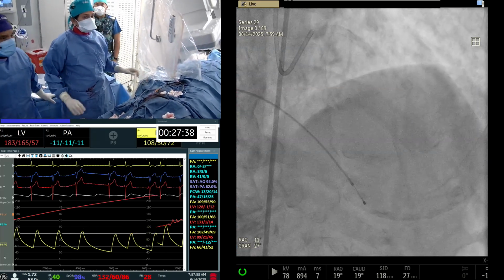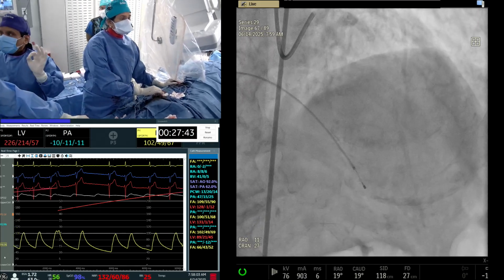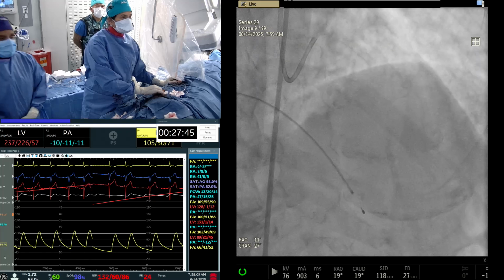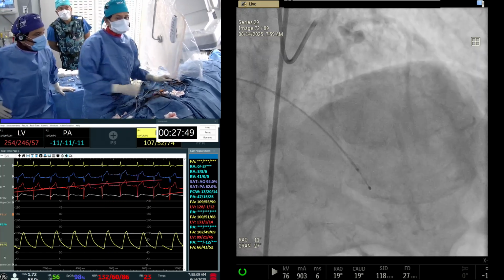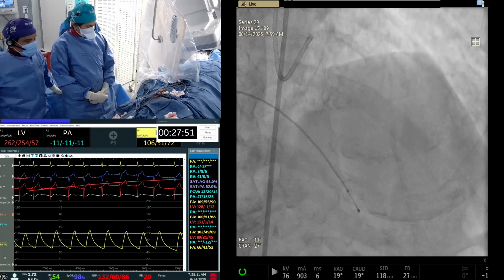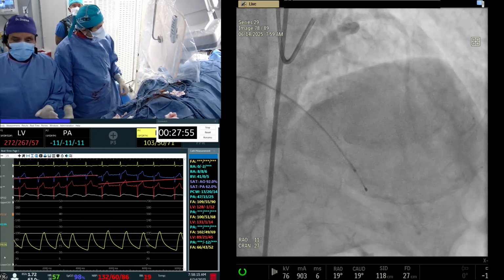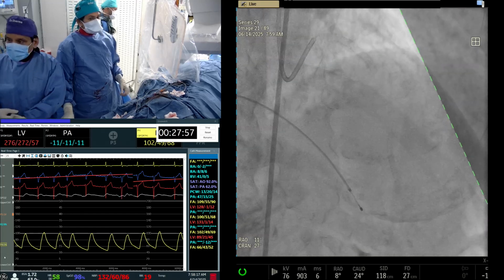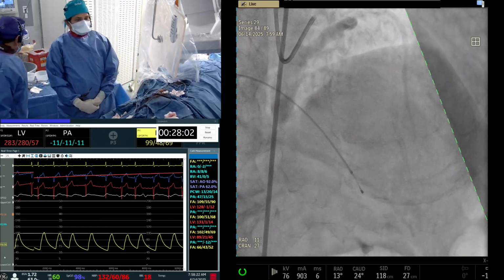Don't do any more picture. All right, anything else? We are done for our presentation right on the dot. We started at 7:02, finished exactly at 8. Good. And the pacemaker is not needed. Do you plan to do TAVI? Let's see. TAVI after 1 month. We wait for 1 month. Again, a balloon expandable valve. In this case, yes.